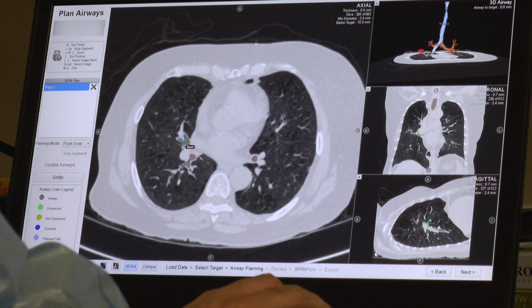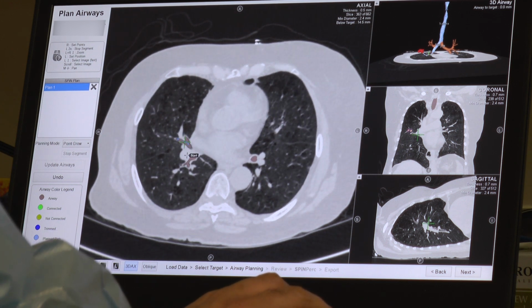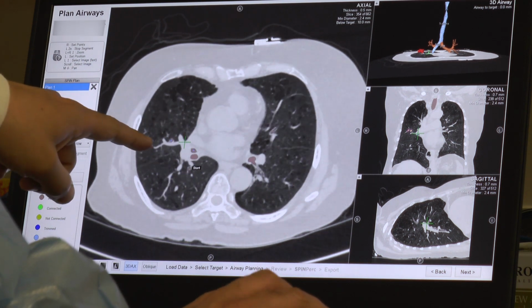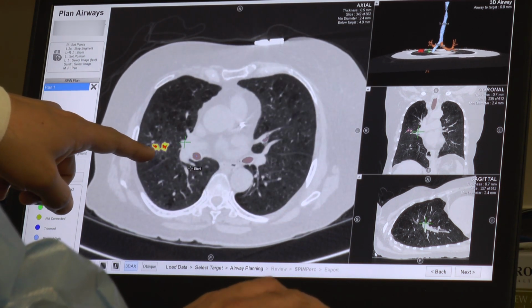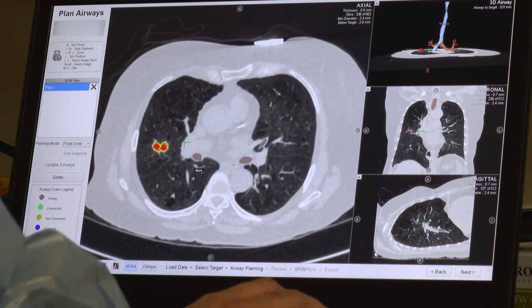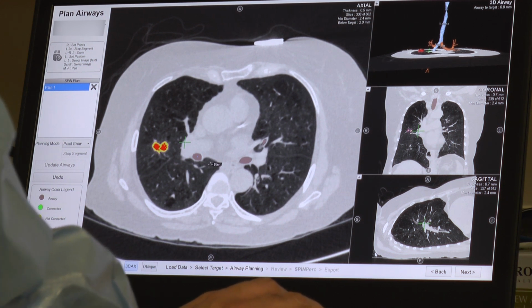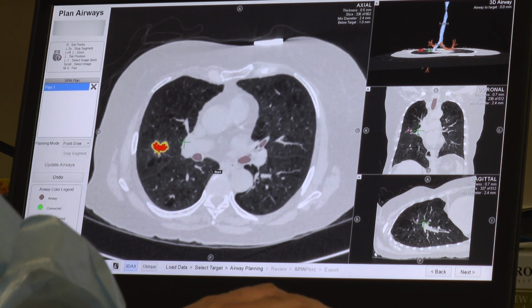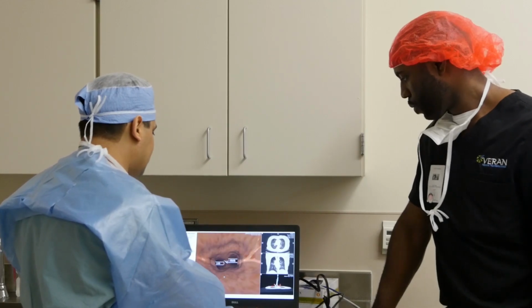And within the lateral, it seems like there's a more lateral subsegment, and sort of going apically from there. That branch goes right into that nodule. So there is an airway going to it, and that makes me feel better about this. But this is going to be a very awkward angle to take, so we may not be able to engage our instruments. So this is the same thing.